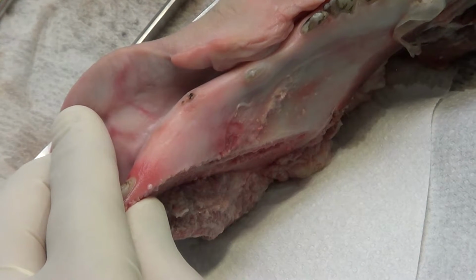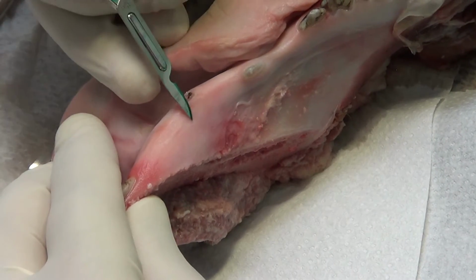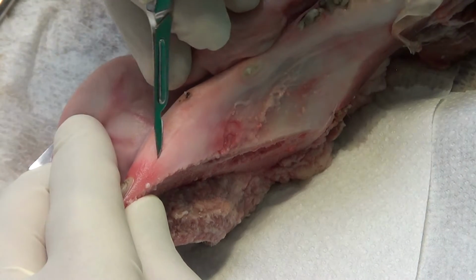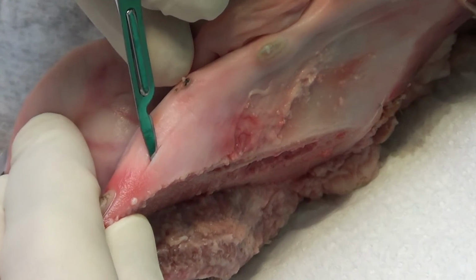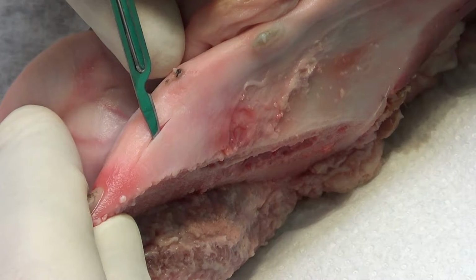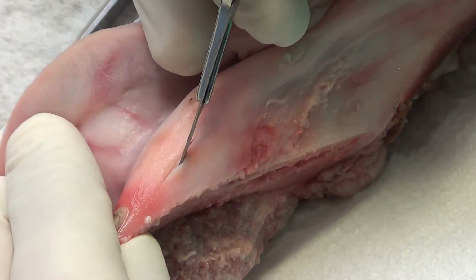Are you ready for the next step? Okay. So now imagine that this is mesial and this is distal. You start modifying the direction of the blade and you start going a little bit deeply. Okay? But look at my blade. It is a little bit superficial.